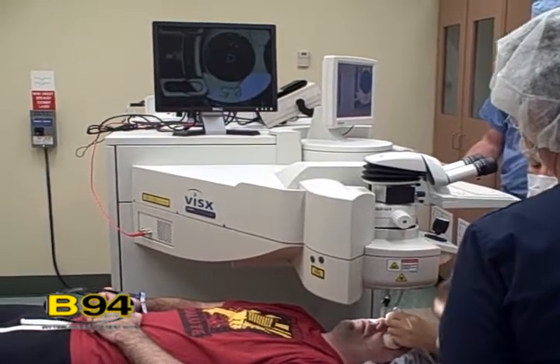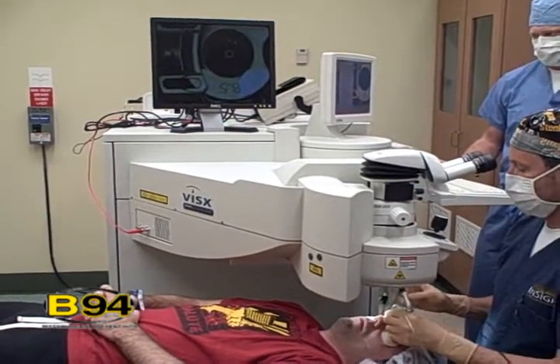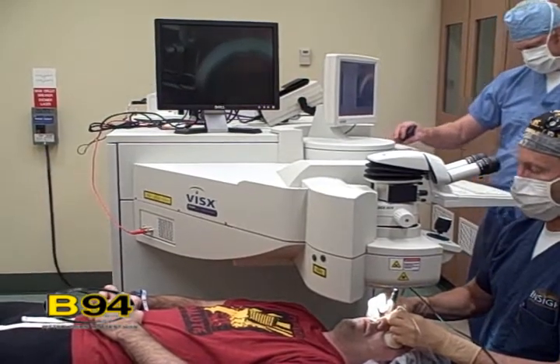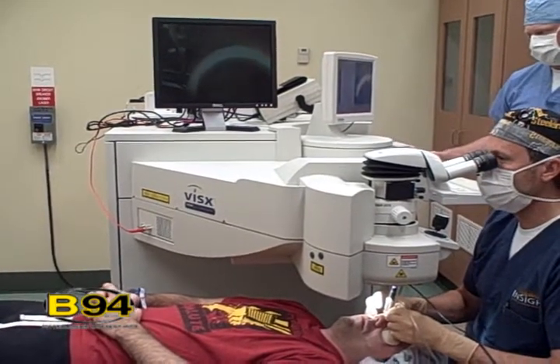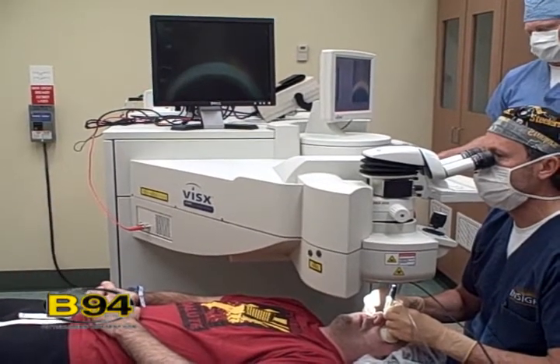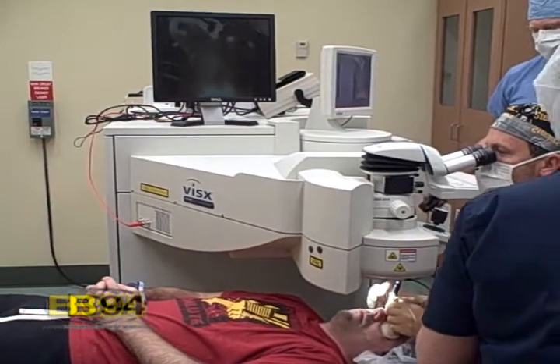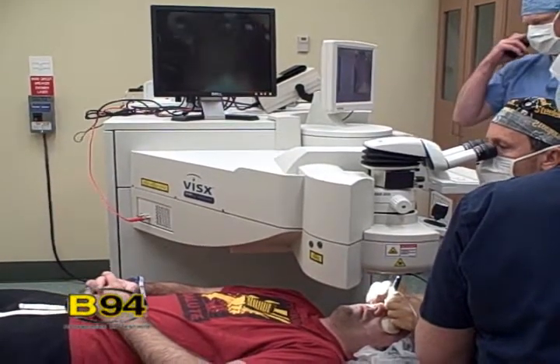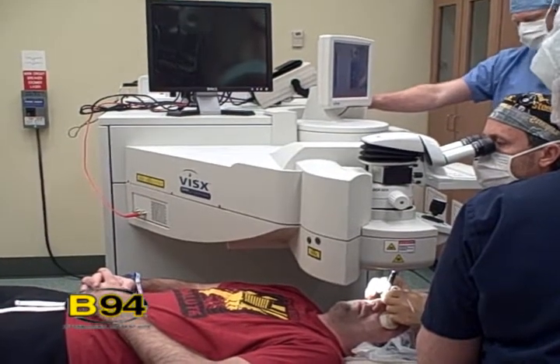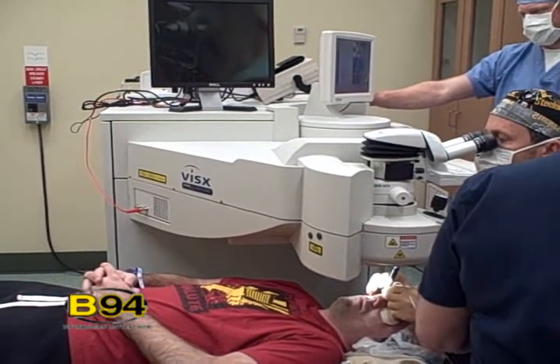The excimer laser is the most accurate laser used in medicine today, bar none. It corrects things at 0.25 microns per pulse — it's submicron precision, almost at the level of wavelengths of light, literally. So it's very accurate. We're going to fix your eyes extremely closely.